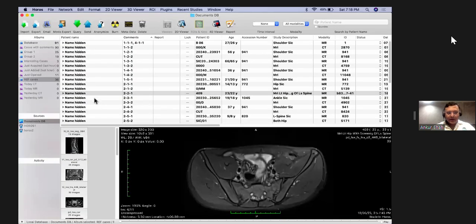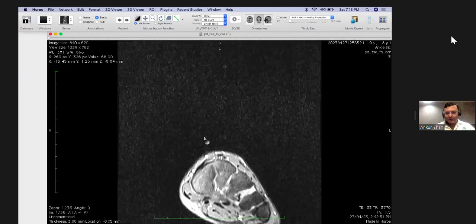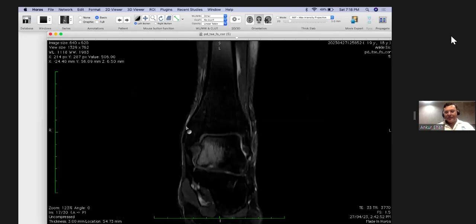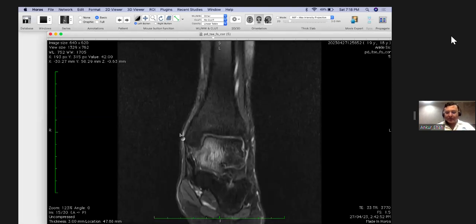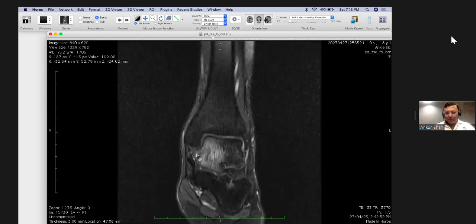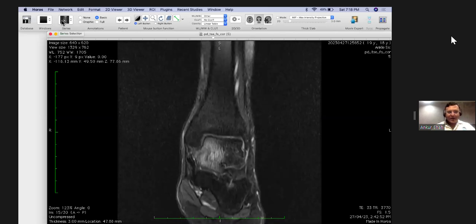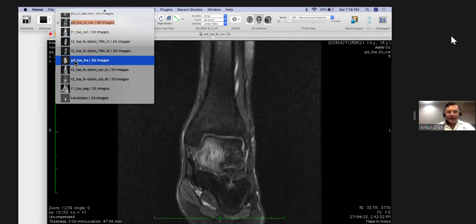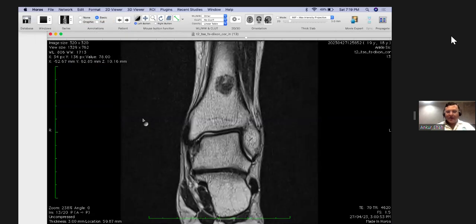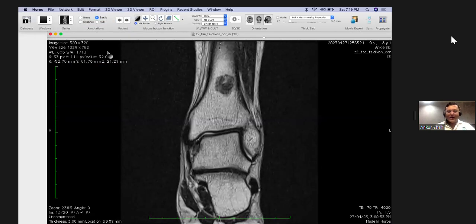Again, similarly, there can be at various sites. I showed you one example of talus, not just the femoral neck. Marrow edema in the talus can be because of some subchondral insufficiency injury, but it is not classically at the weight-bearing region, and it is much more severe compared to that small focal subchondral edema only on one side. Again, as I said, MR can sometimes be misleading or difficult to detect that small nidus on MR.